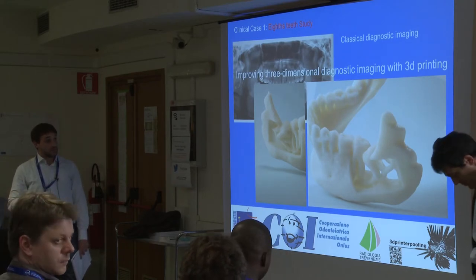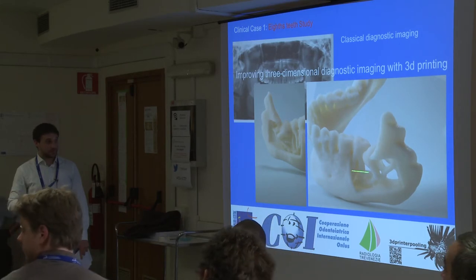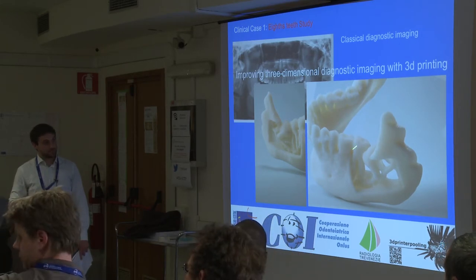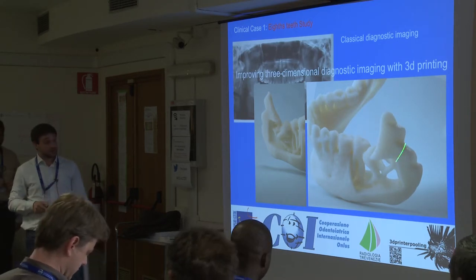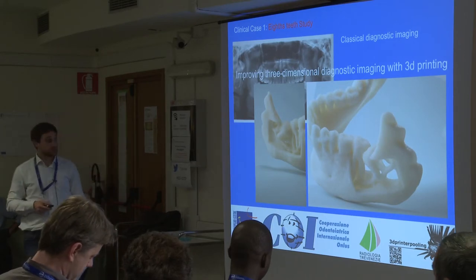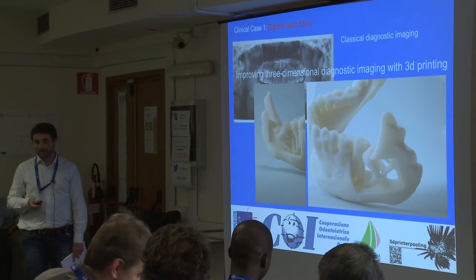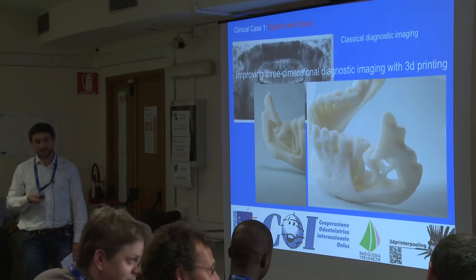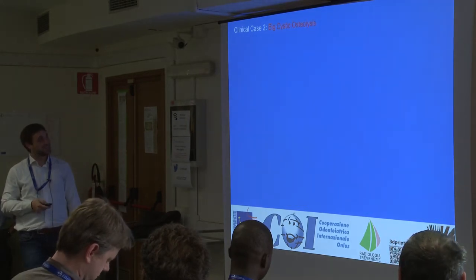And with 3D replicas, the dentist can have the problem in his hands, and can explain the problem to the patient, and it's easier for the patient to agree with the clinical solution.